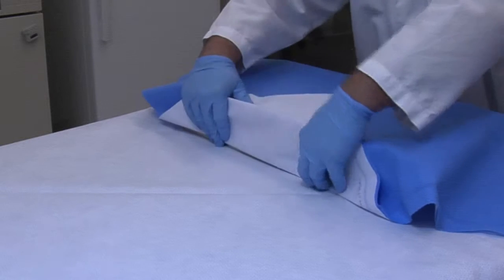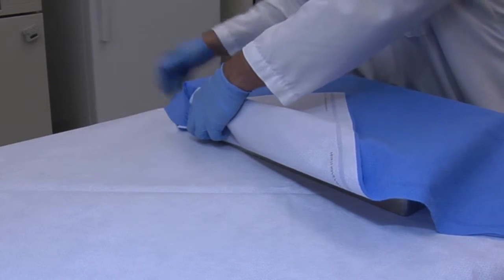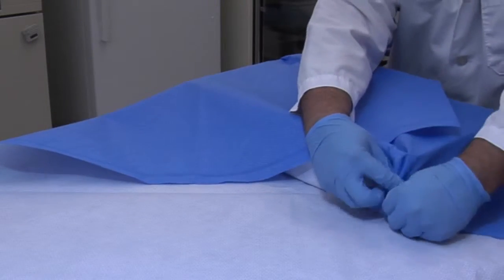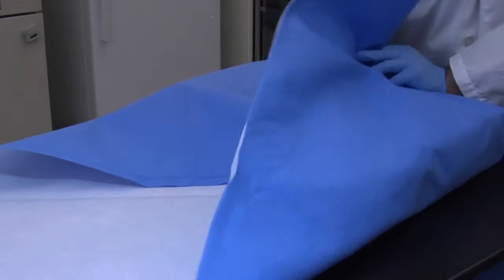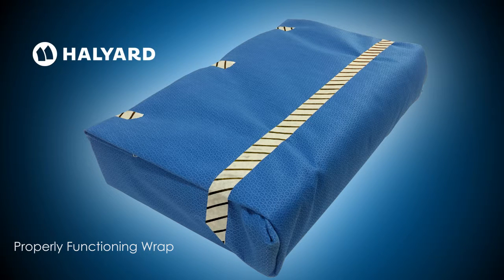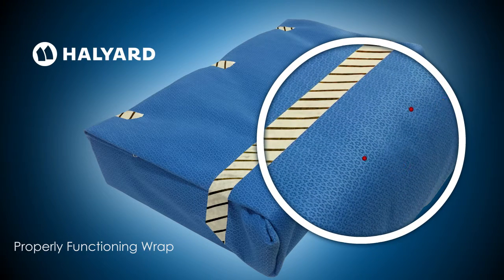When using sterilization wrap, it must be handled according to AAMI recommended practices and wrapped per the manufacturer's instructions in order to prevent tears and openings. The wrap itself acts as the filter, keeping particles out. Halyard Health Sterilization Wrap also has a proprietary technology called PowerGuard that embeds a charge in the material that captures small particles like airborne bacteria.